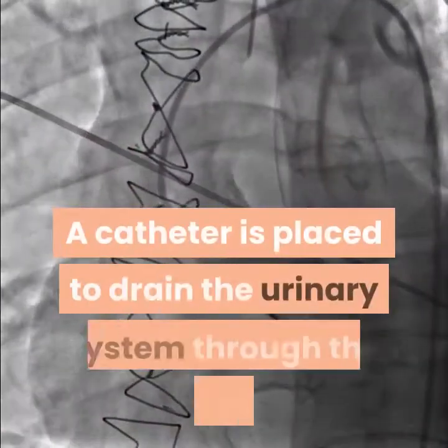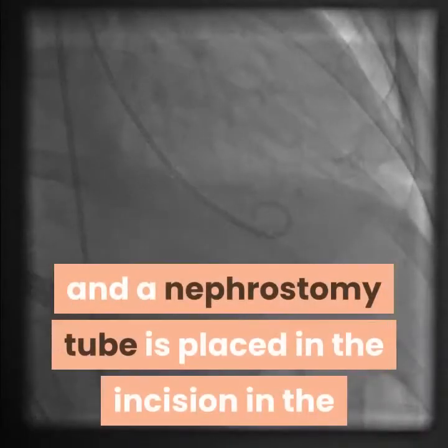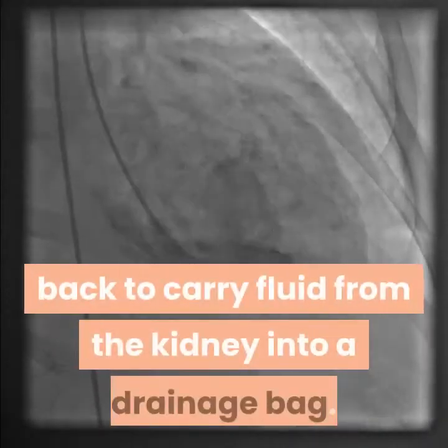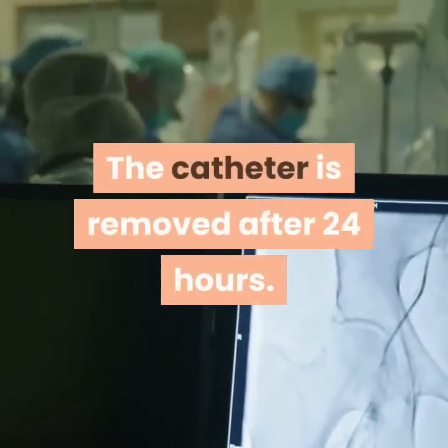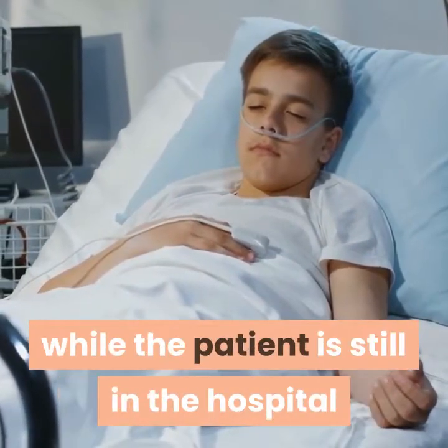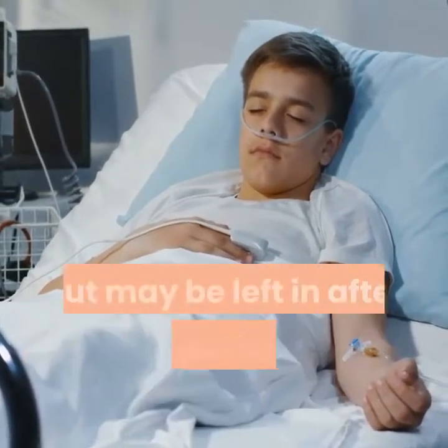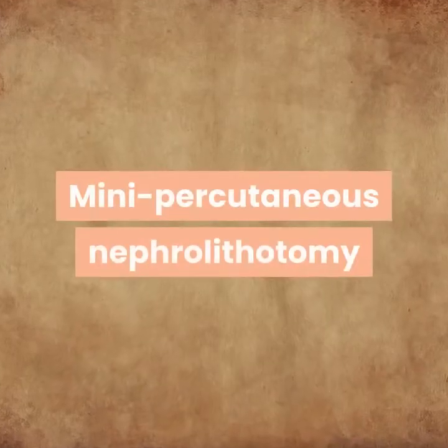A catheter is placed to drain the urinary system through the bladder and a nephrostomy tube is placed in the incision in the back to carry fluid from the kidney into a drainage bag. The catheter is removed after 24 hours. The nephrostomy tube is usually removed while the patient is still in the hospital but may be left in after the patient is discharged. Mini percutaneous nephrolithotomy.